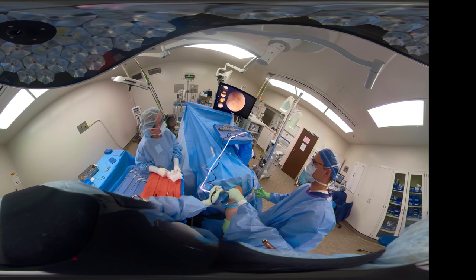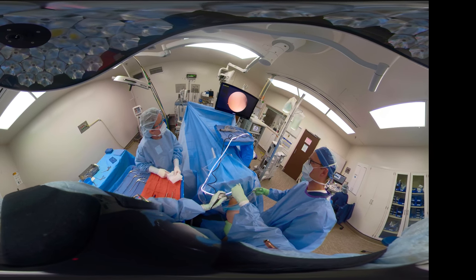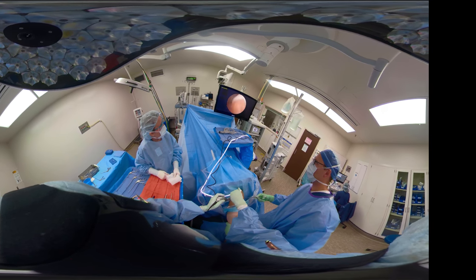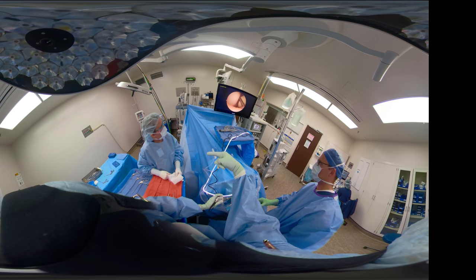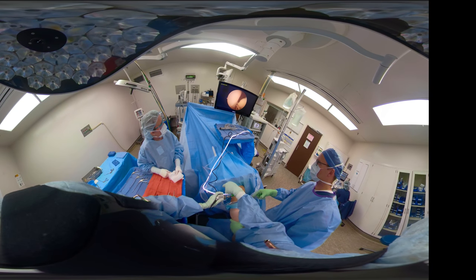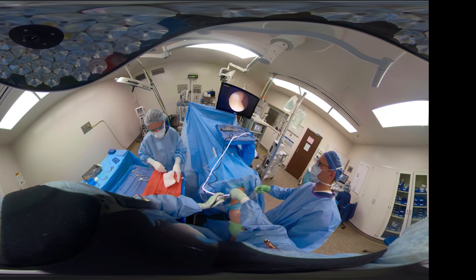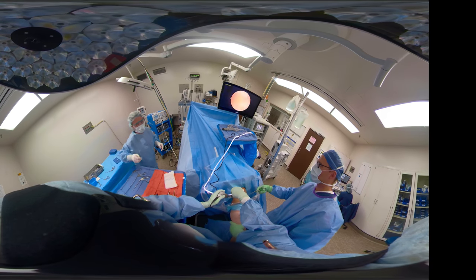And if we want to make sure we don't lose it, we can put it in the notch, and that's a good backboard, so you don't end up losing it in the suprapatellar pouch. And the other trick is to use your knife to make a little bigger medial portal so you can get this out without losing it in the soft tissues. You lose it in the soft tissues, it's not a big deal, but you do have to then maybe put your scope medially and find that loose body.